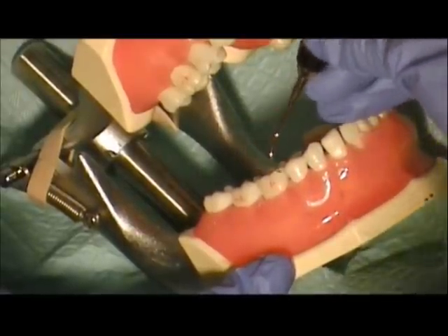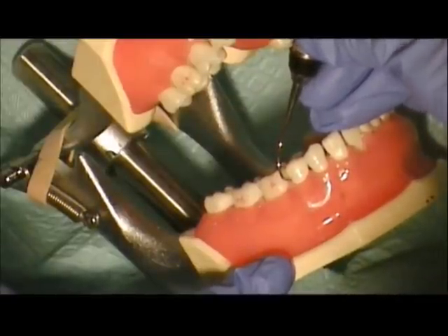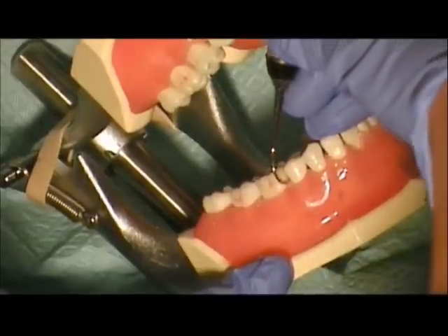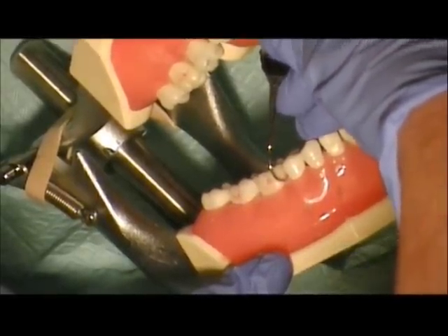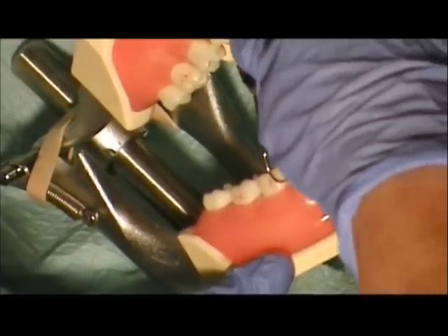On the mesial, once again, we line up and look at our terminal shank. It's got a 90-degree face-to-tooth relationship, so we're going to need to tip the face. We stand up as high as we can on the fulcrum to get to our 70 degrees to engage our strokes.